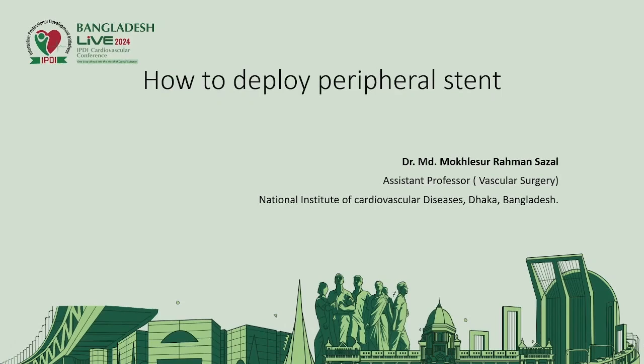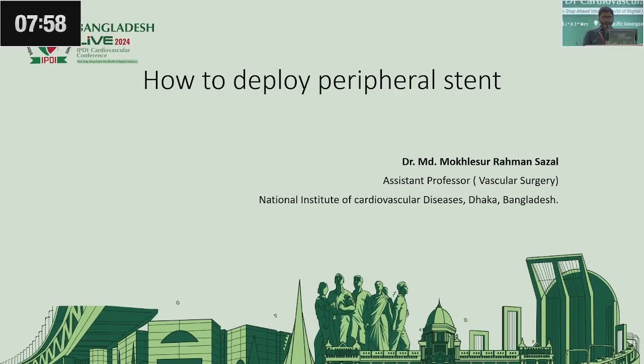Assalamu alaikum, my respected teachers and my colleagues. Welcome to today's endovascular session, step by step. My topic is how to deploy the stent.